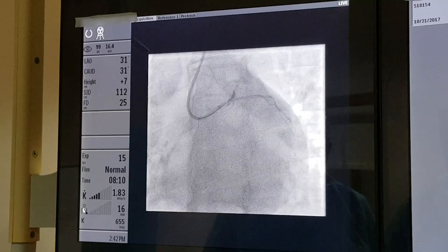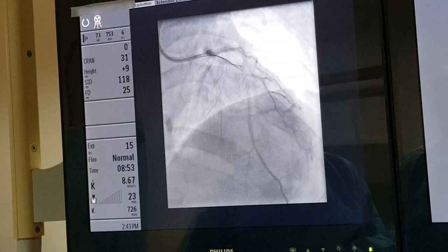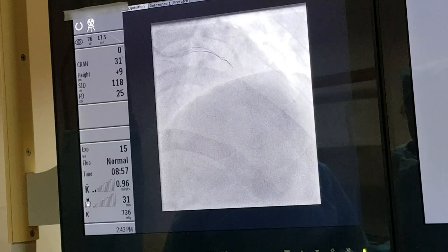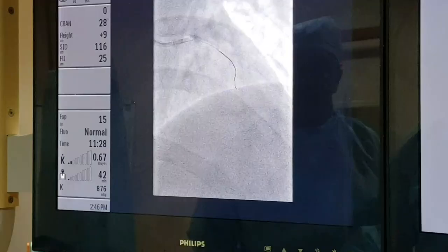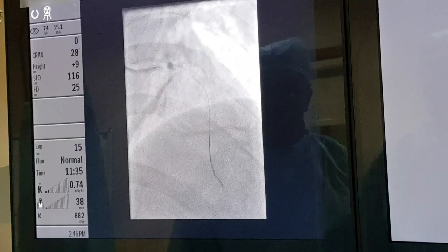The wire is near the block. Now I will advance this wire. Now I have crossed the block — you can see that I am advancing the wire into the coronary artery. So now I have crossed the block, and all the ballooning and stenting will be done over the wire.